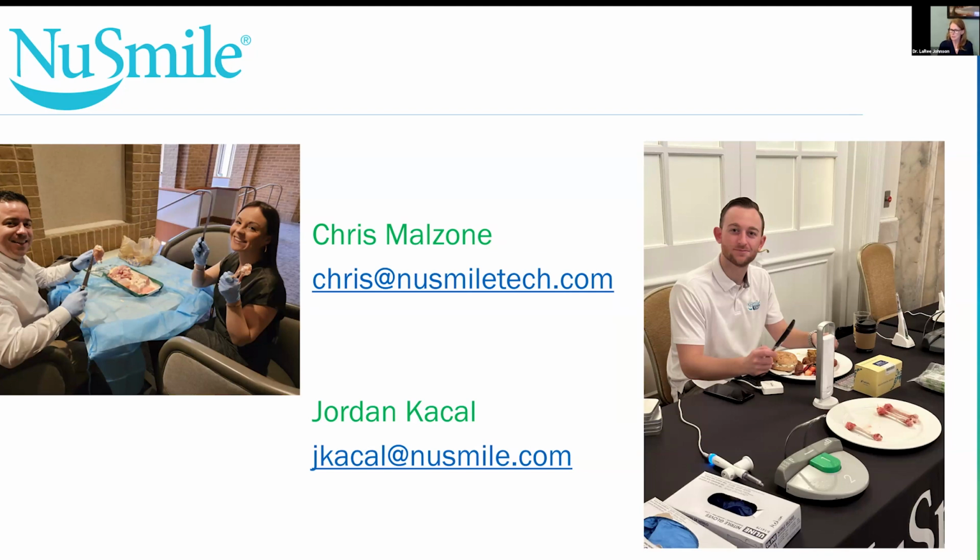A lot of people ask me, well, I don't put the raincoat on, I don't do any of that anymore, the dental assistant. Well, if you're a raincoat person, which I'm both, I use Isolite for sealants, I use a raincoat for restorative. If you are a raincoat person, you just quickly put it on yourself, which takes about 2 seconds. You guys saw me do it in all those videos. I just pick it up, put it on, get on with it. So yes, you lose the luxury of someone else isolating for you in this situation, but you save time by a landslide and you move rather swiftly.